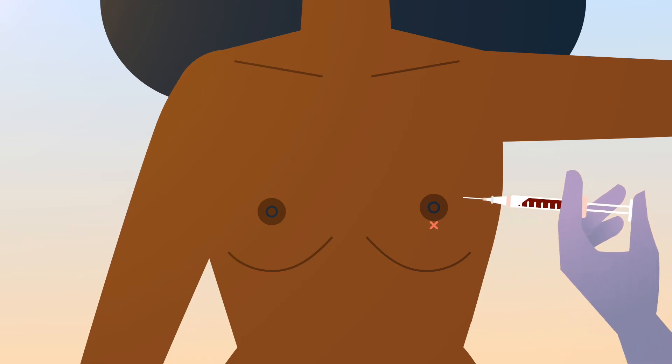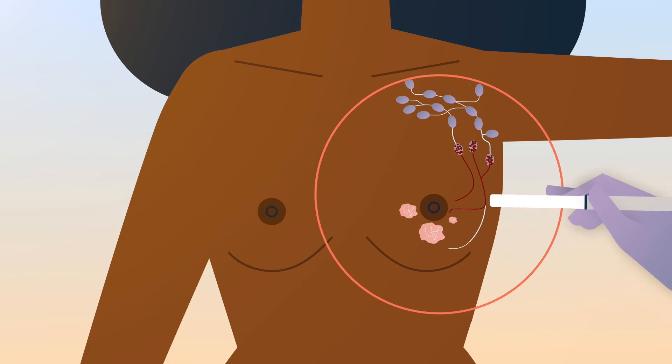During surgery to remove the DCIS, MagTrace is injected into the breast, and will naturally migrate to the sentinel nodes, where it will remain in place and provide a continuous reference for upwards of a month.